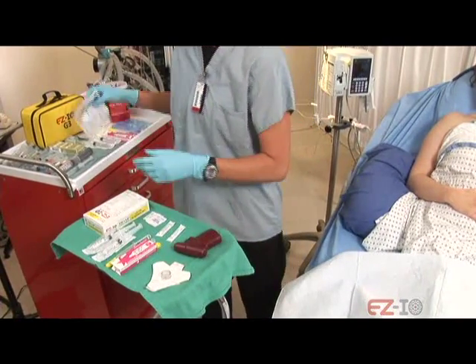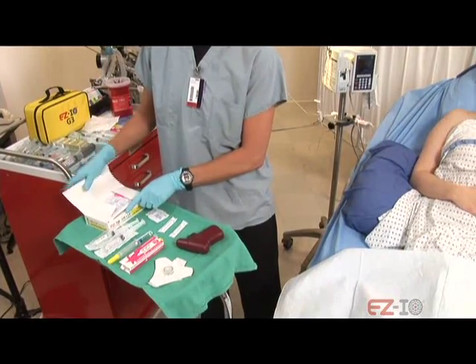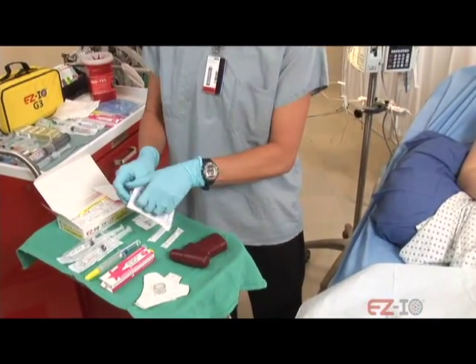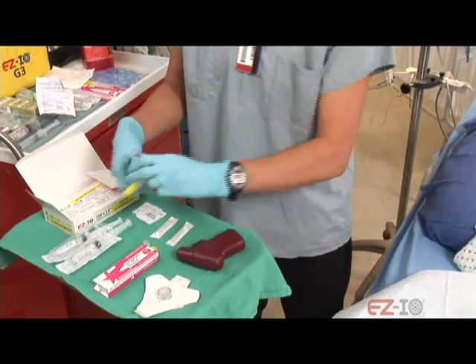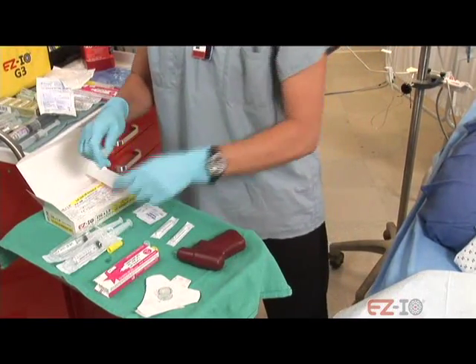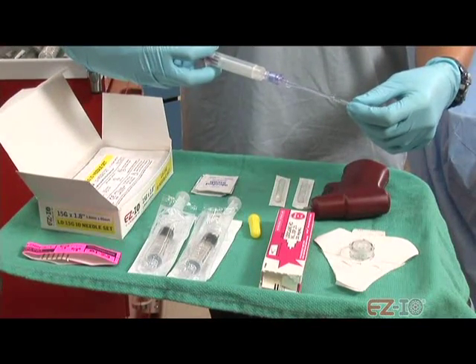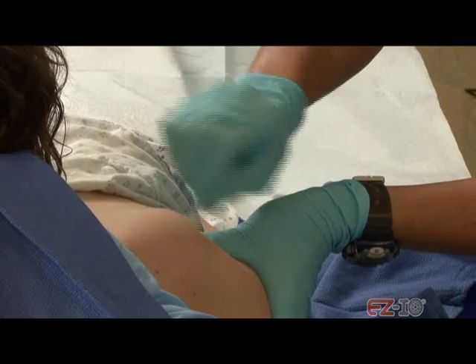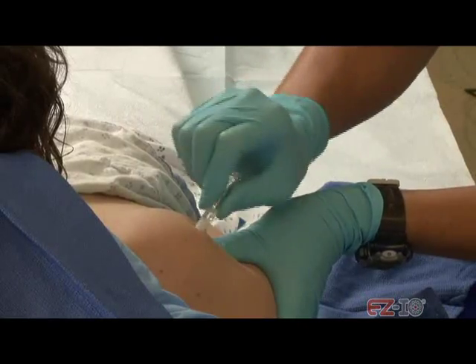When you're ready to place the needle, remove the EZ-IO driver from the case and remove the trigger guard if present. Select the appropriate needle set and inspect the packaging and cartridge for damage. Open the EZ-Connect tubing that comes with a needle set. If the patient is responsive to pain, administer 2% lidocaine without preservatives or epinephrine — also known as cardiac lidocaine — for anesthesia prior to your initial saline flush. Prime the EZ-Connect with the appropriate amount of lidocaine.